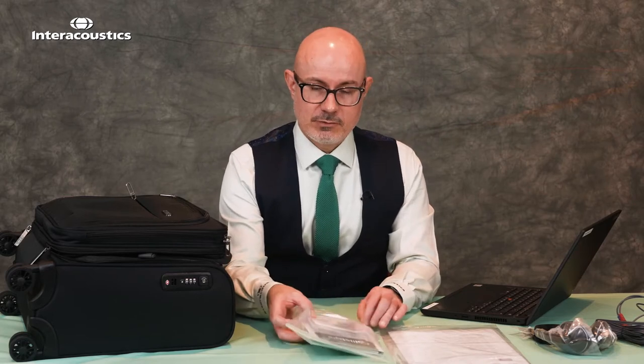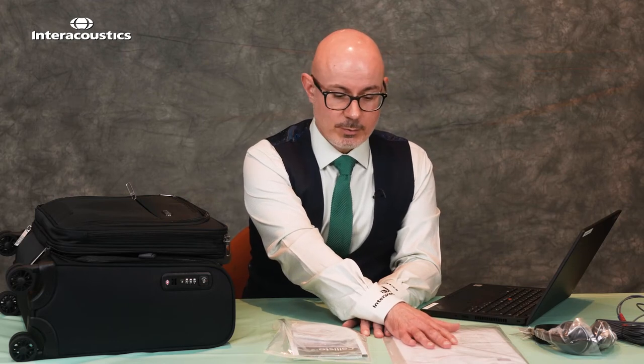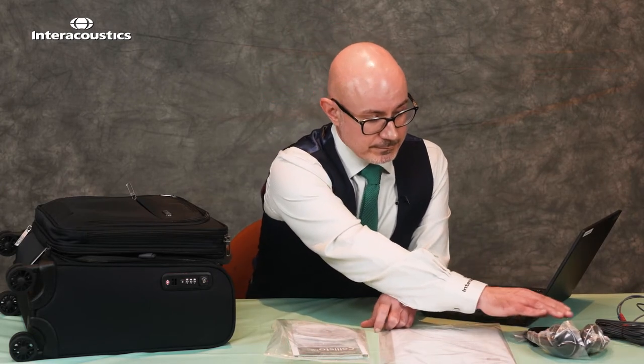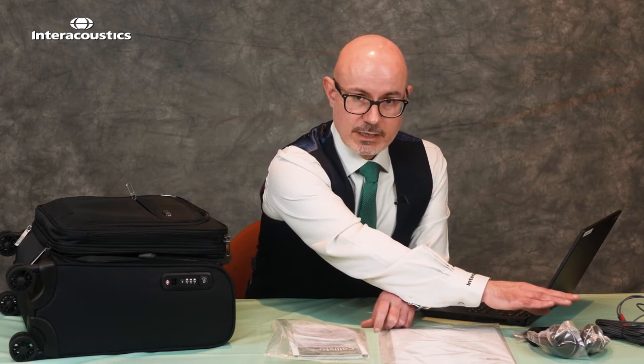Welcome to this video looking at what comes with your standard Callisto package. In your box, after you've removed all of your items, you'll find a CD-ROM with the software, a packing list which should include everything that is in the box along with the calibration data on the back, a headset for monitoring, and just over at the end here we've got the REM headset for the real ear measurement.